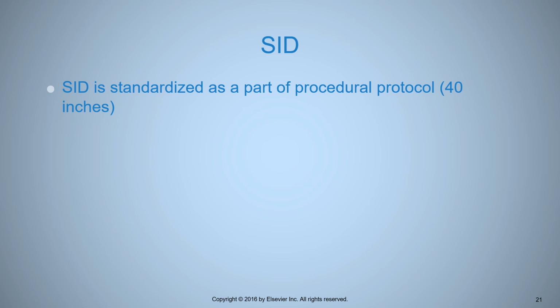Even the cross table projections, we still get pretty good body part to image receptor contact or proximity. And so remember, the strategy to increase SID to 72 or something like that is to compensate for OID that we can't correct. And we'll see that next week in the C-spine. When we do our lateral C-spines, we're going to invoke a 72-inch SID because it's just rude to lop the patient's shoulder off so that we can get the cervical spine right up against the image receptor. It's problematic. But for the pelvis and the hip, most of these projections, even in the case of fracture, you're not going to have trouble getting them with close to zero OID to the image receptor. Okay. So 40 inches is perfectly fine for all of these.